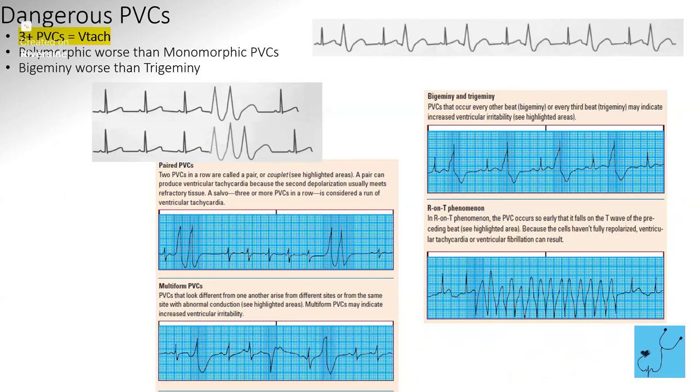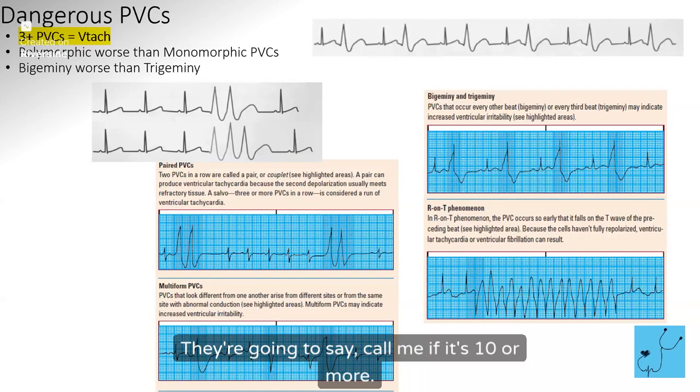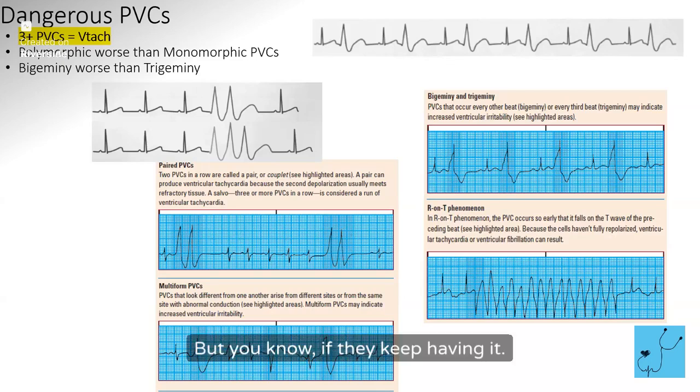Technically. The cardiologist is going to be like, no, it's just 3 PVCs. They're going to say, call me if it's 10 or more. Yeah. But, you know, if they keep having it.